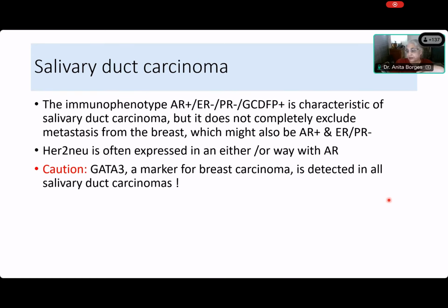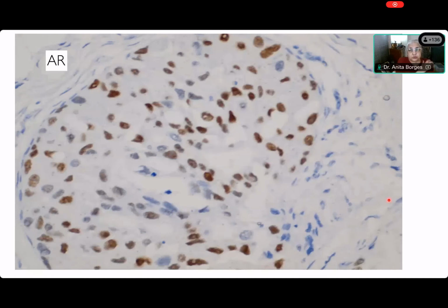So this is a salivary duct carcinoma, and immunohistochemistry can be very deceptive because it also expresses GATA if you bother to do it. Which I mean, I've stopped doing all of this. For the purposes of therapy, you can do a HER2 and you can do an AR, because if it is expressed, then this can be used as a target for these tumors. And here, this tumor expressed androgen receptor. That is what AR is.